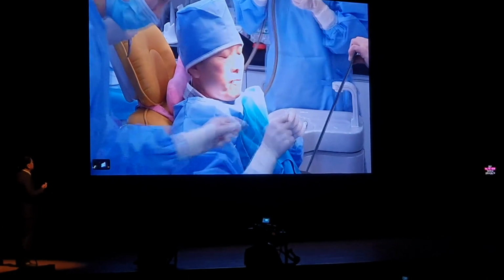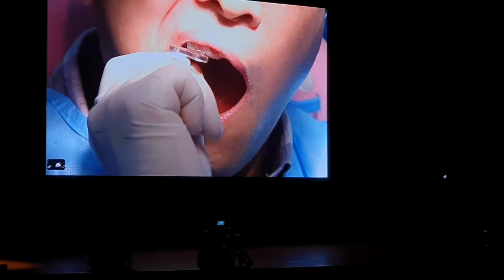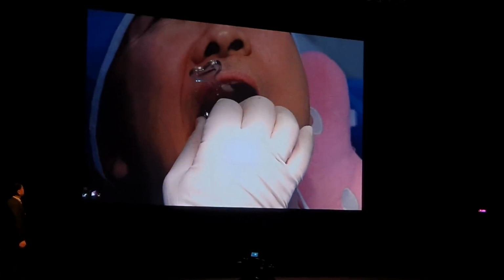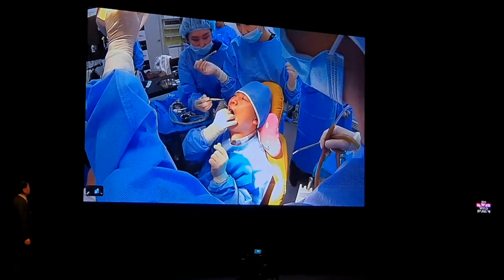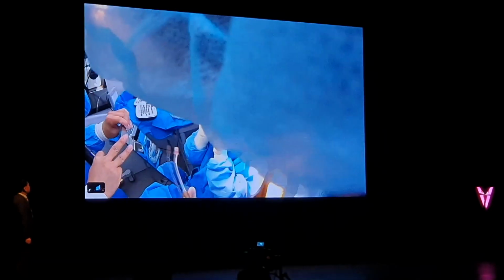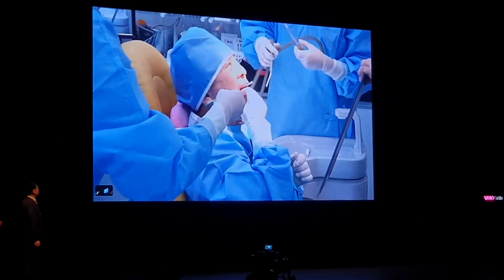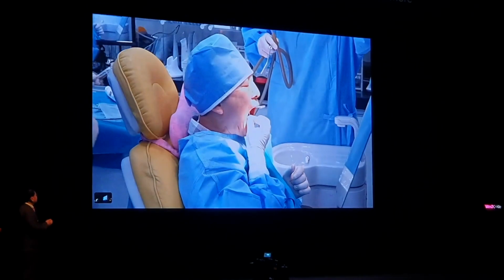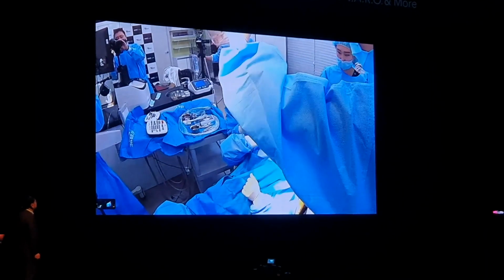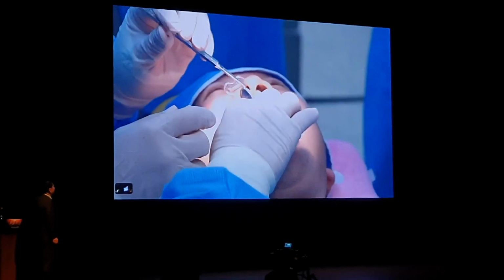Alright, the implant has been successfully placed. Now he's connecting a torque wrench. Incredible. Just like that at once, that wouldn't be possible if I were him. Shall I take over for torque wrench? I think that would be a good idea. So I think it is very difficult to make it seated at once. Okay. I thought I came here to do the surgery, but I guess I'm here to use a torque wrench today.